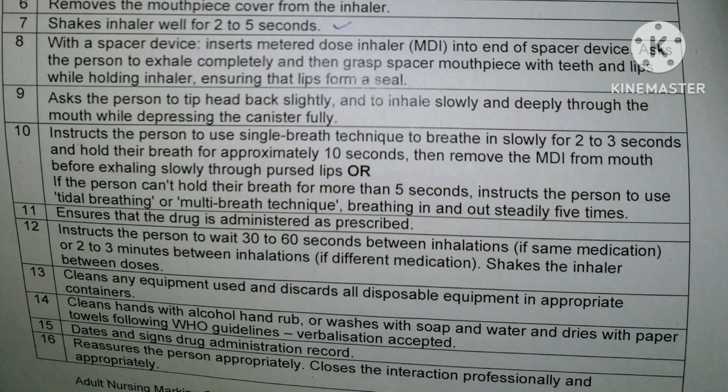So we should instruct them: exhale completely, then grasp the spacer at the mouthpiece and cover it with the teeth and lips to make a tight seal. Then ask the person to tip the head back slightly and to inhale slowly and deeply through the mouth while depressing the canister fully.